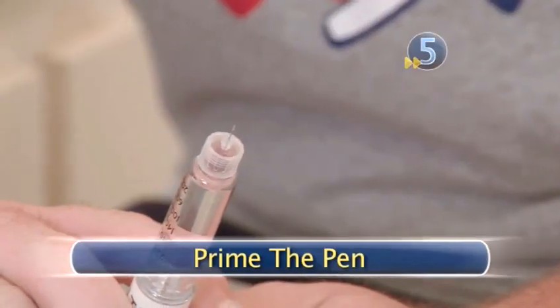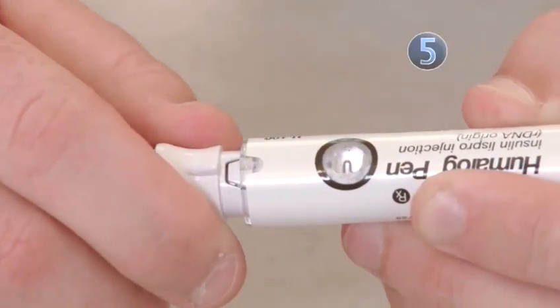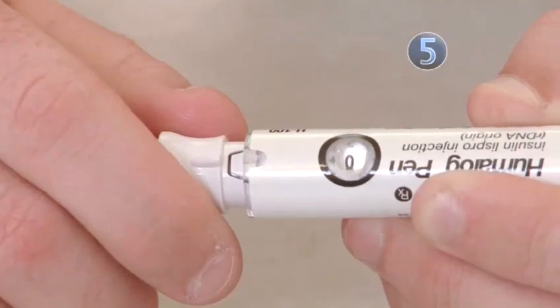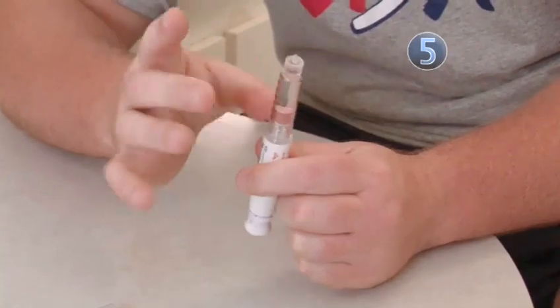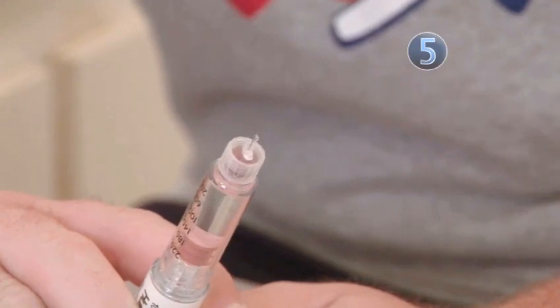Step 5. Prime the pen. Turn the dose knob to the arrow. Pull the knob out until a zero appears in the dose window. Turn the dose knob clockwise until a 2 appears in the dose window. With the needle pointed up, tap the cartridge holder gently. Push the injection button firmly. You should see several drops or a stream of insulin coming from the needle tip.